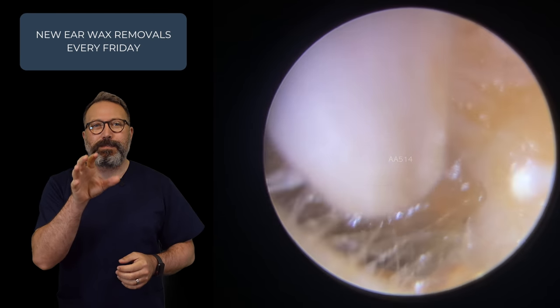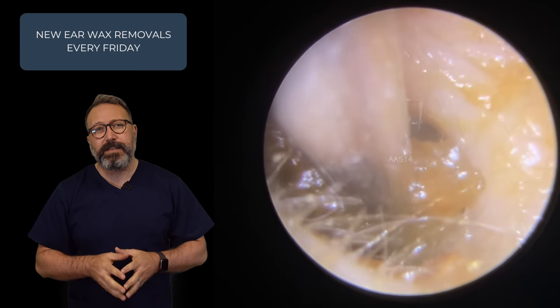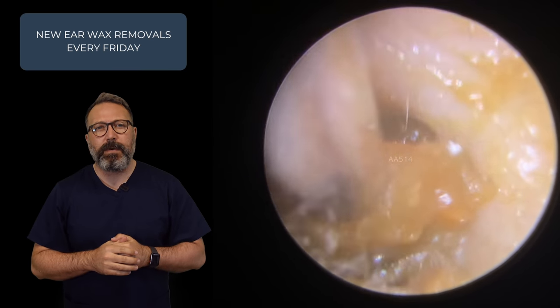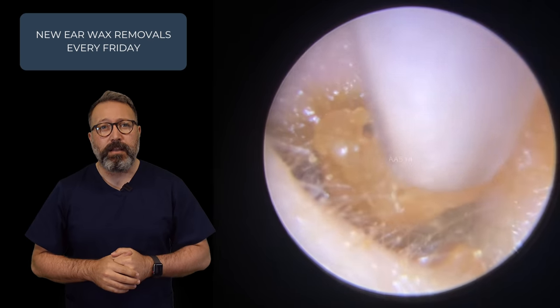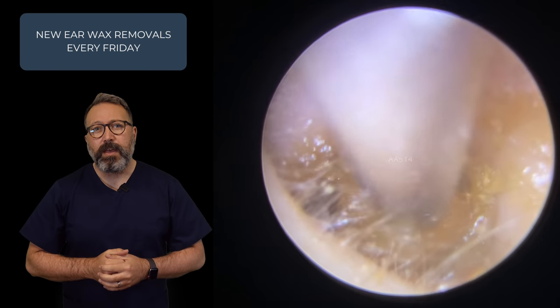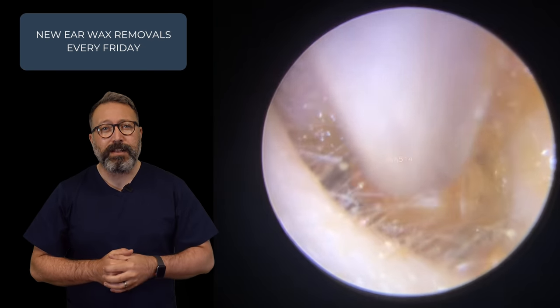So you can see that this patient's come through — they've got some very, very sticky wax sitting about halfway down the ear canal. There's a little tiny gap at the top, but as you can see it slopes upwards further past that gap, so it's really plugging this patient's ear canal. We've got the standard size Zoellner tube in here and we're just taking these little bits of wax away first, and then we get a grip on this much, much bigger piece sitting a little bit further in.